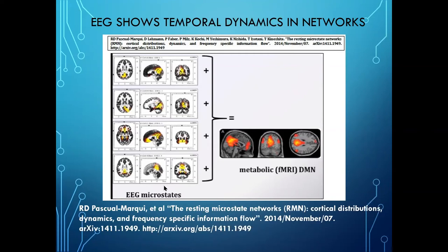And this is the posterior cingulate all by itself. So why is this a big flare? It's there all four times. The others are there 1 out of 4. So this is big, those are small. If you model this network as though it has to all be there at the same time, you won't see it.